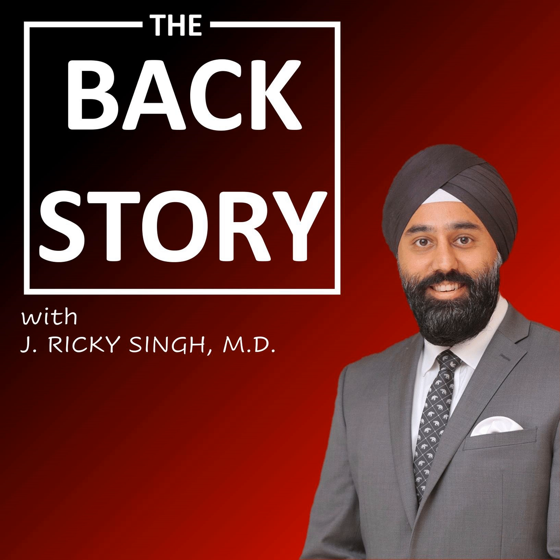But if you do decide that this was the right thing for you, and I'll say that probably 80 to 90% of patients do believe that, we schedule a separate date for an implant surgery. And this is an outpatient surgery where a small incision is made to secure the wires under the skin and a small incision for the battery to be placed, so that the whole system is under your skin and you can go about swimming and showering and doing all the things that you used to do without any sort of worry. And these systems last anywhere from 5 to 10 years. You don't really need repeat surgery to revise the system unless something were to change, like the wires moved or the battery needed replacement. So it's pretty long lasting for patients.